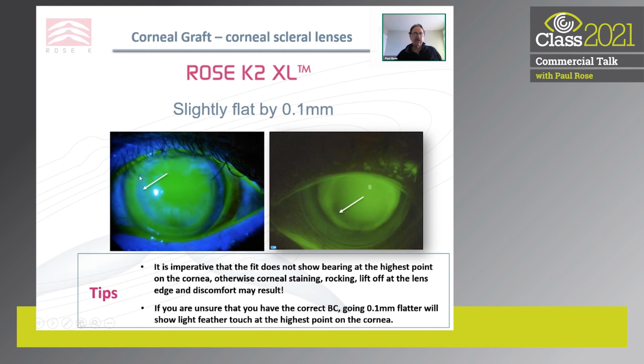So this is slightly flat. You can see over the edge of the graft here, we are slightly flat. And again here, I don't really want to see any feather touch at all. I want to see that cleared. And once again, with grafts, the most common place you have to judge the base curve is along the edge of the graft, not centrally.